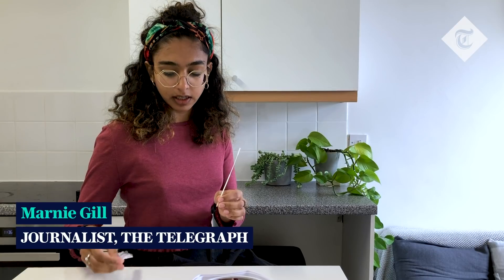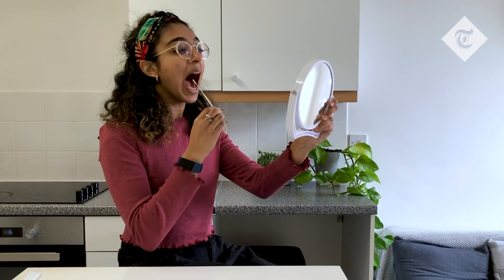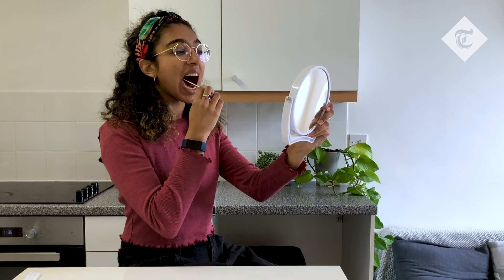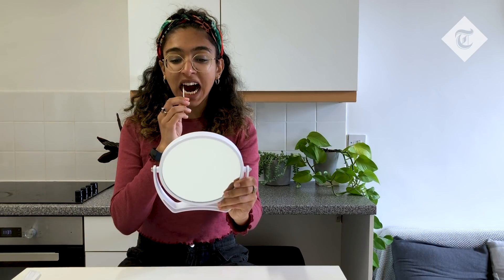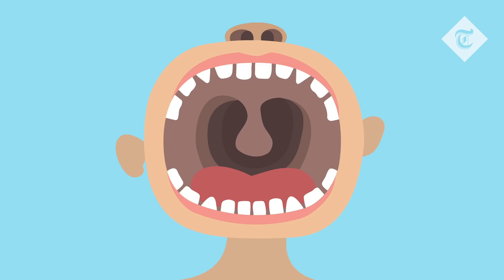Next we'll take a sample using the swab. Holding the stick end, make sure the fabric end of the swab doesn't touch anything apart from the inside of your nose and your tonsils. Taking a sample from the back of the throat, wipe your tonsils or where they would have been five times on each side. You may find it helpful to use a mirror. Here are where your tonsils are.